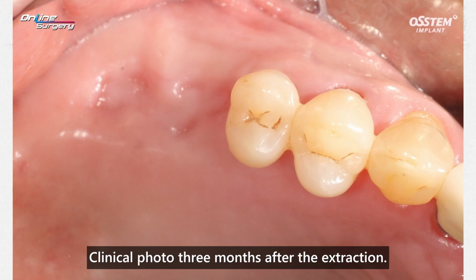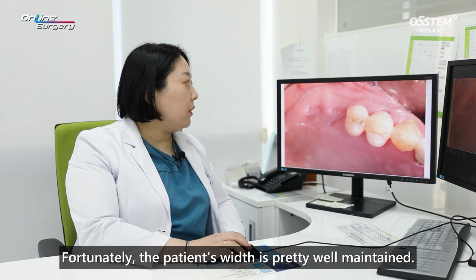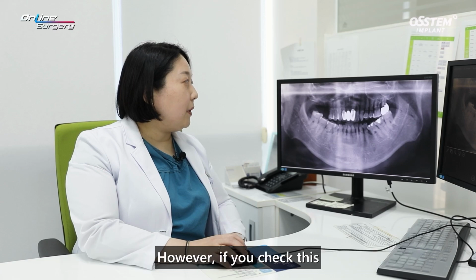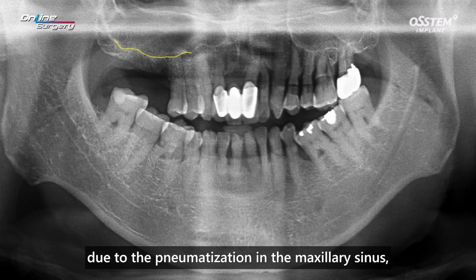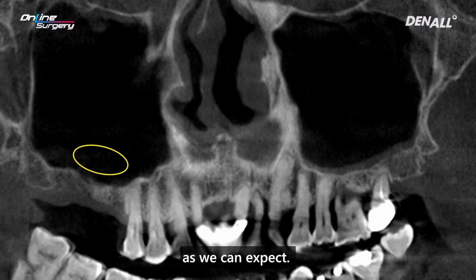Clinical photo 3 months after the extraction. Here, extraction socket is very well healed. Fortunately, the patient's ridge width is pretty well maintained. However, if you check this panoramic image at the extraction site, due to the pneumatization in the maxillary sinus, the available alveolar bone height is very much limited, as we can expect.